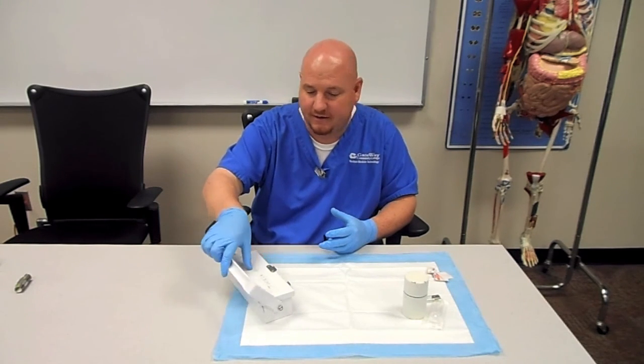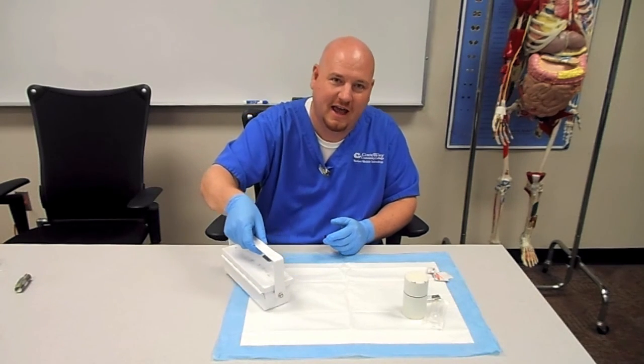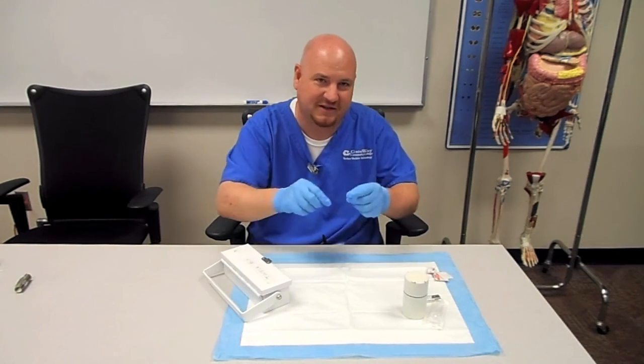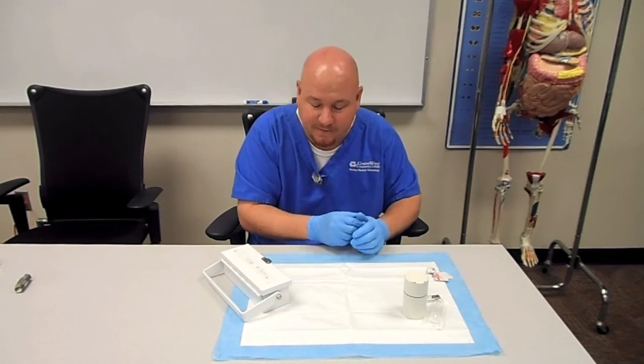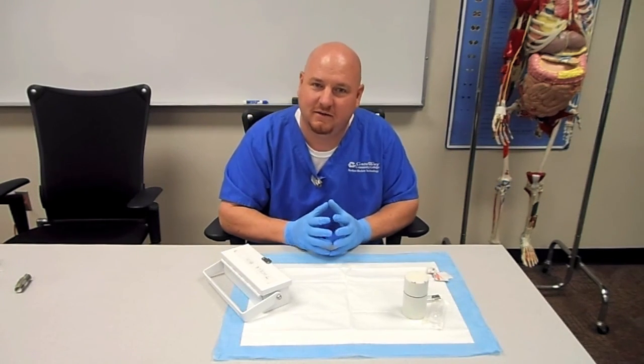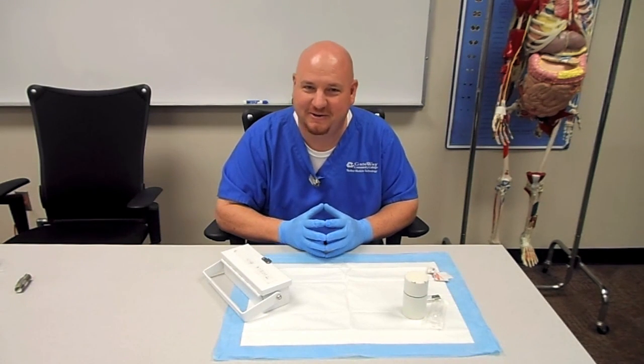At this point the dose has been assayed. Take it over and double-check everything with the stickers — double-check again just because it's blood, check the bracelet again, and then they can get their injection. It's ready to go. That's how you do an UltraTag kit.